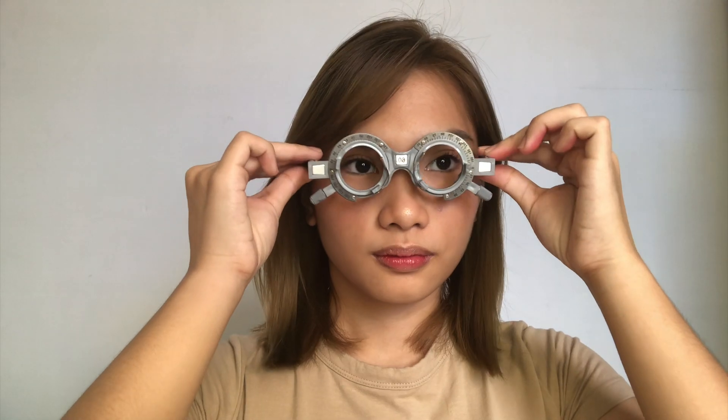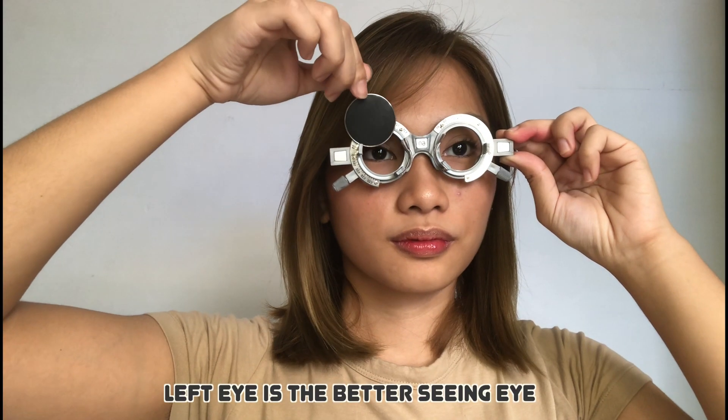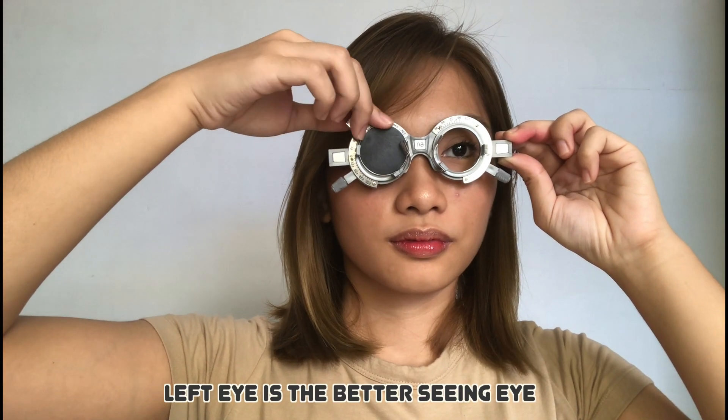The test is performed monocularly, starting with the better seeing eye first. In this case, the left eye is being tested while we occlude the right eye.